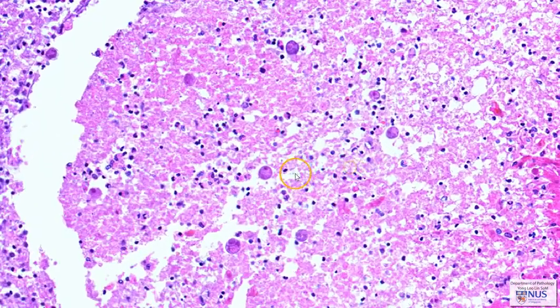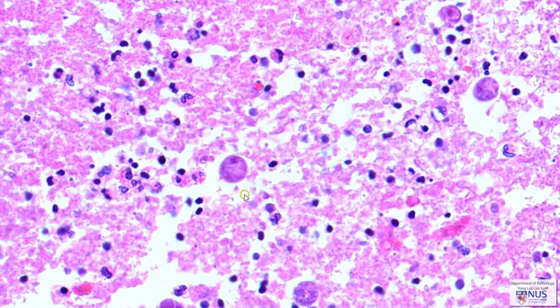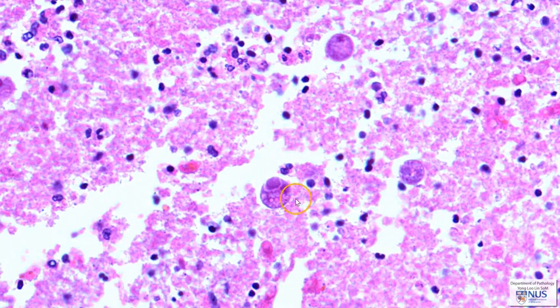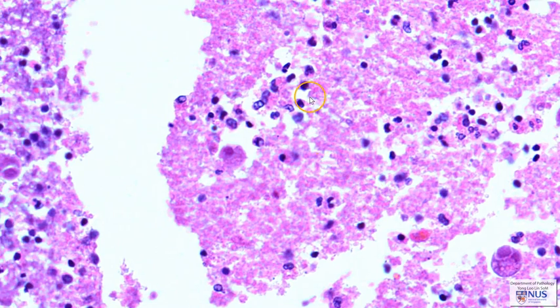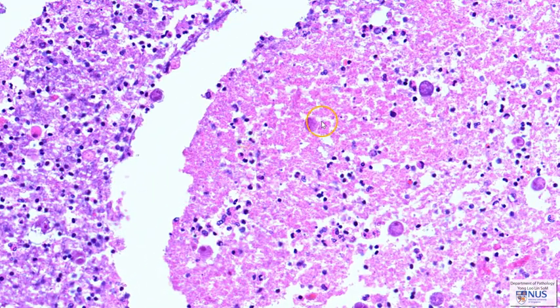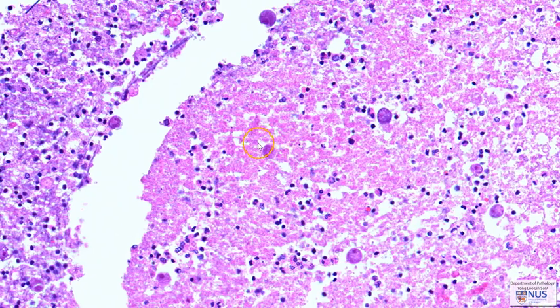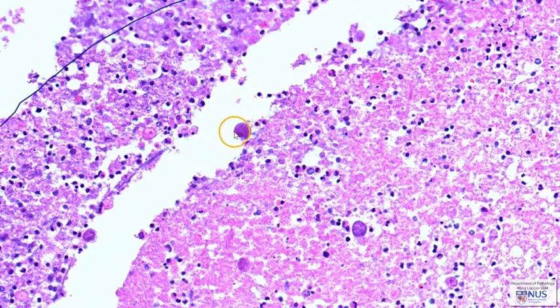They have eccentric rounded nuclei, and it's difficult to appreciate the nuclei here because many of these cells are degenerate. Here you can see the nucleus, and quite often the organisms ingest red blood cells, so we may sometimes see red blood cells in the cytoplasm. There are several other highly degenerate amoebic organisms here.